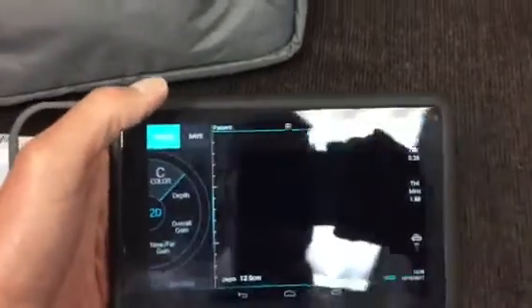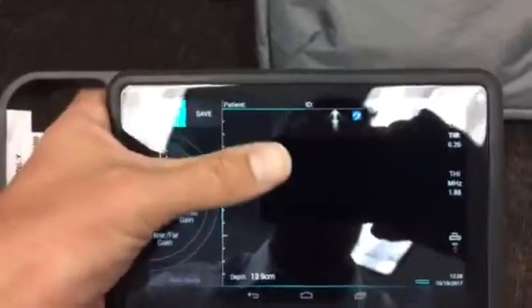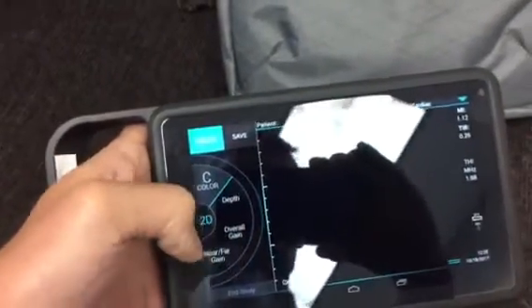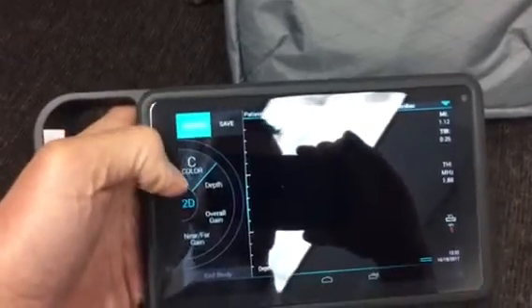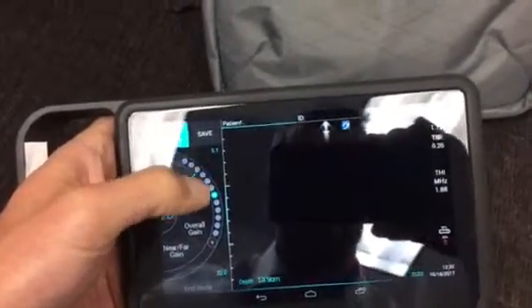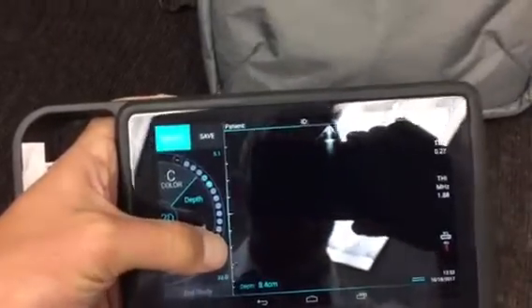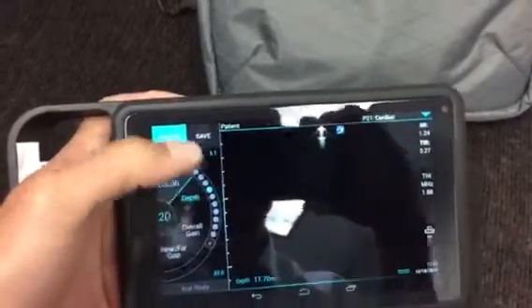We have an ultrasound sector on this side, and you'll see that all the controls are going to be manipulated by my thumb while I would be scanning with the probe. The essential controls including depth can be controlled here either by touching one of the little circles or by pressing the plus or minus signs, and you can see the depth markers on the screen changing.